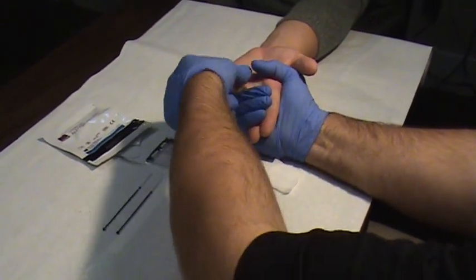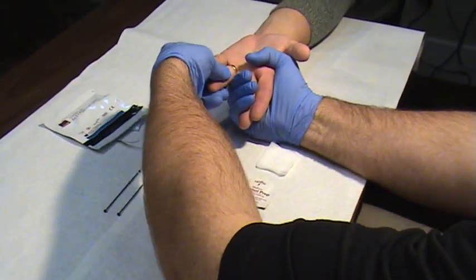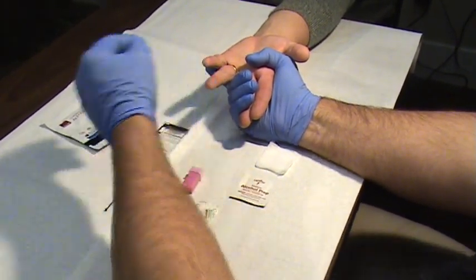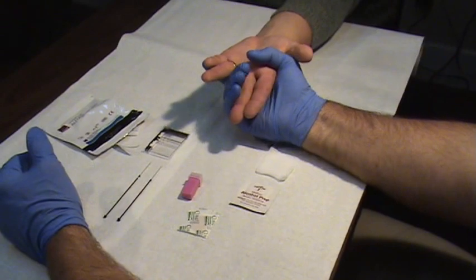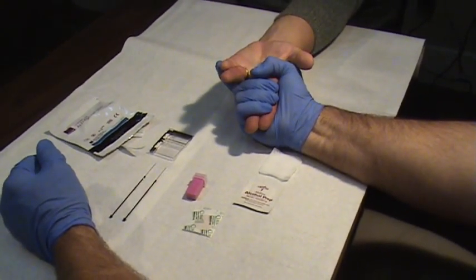Be careful not to stroke the finger. As you're trying to get blood down to the area, you'll get a false reading. You're using some extra skin tissue and cells in your blood sample, and it'll give you a false reading. So you just want to apply constant pressure. Make sure that the finger's ready to go.